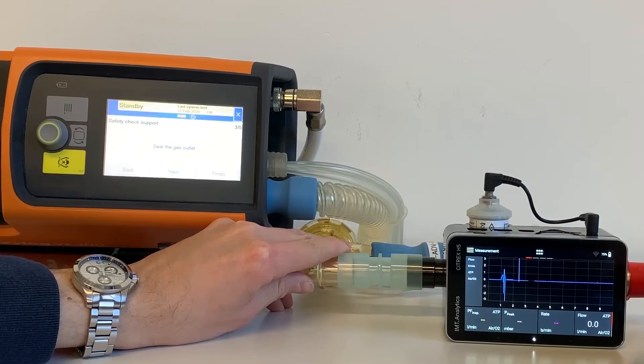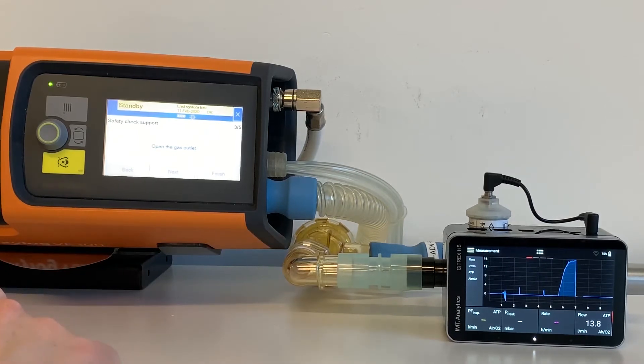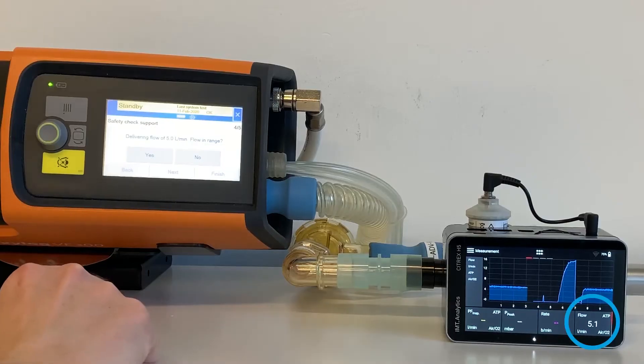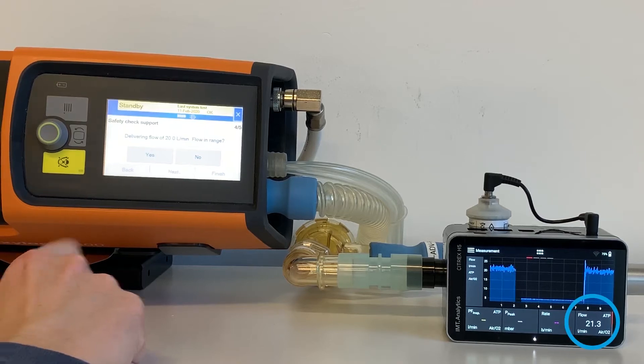Seal the gas outlet, then open the gas outlet. Check the delivering flow of 5.0 L per minute. Is the flow in range? Tap Yes. Check the delivering flow of 20.0 L per minute. Is the flow in range? Tap Yes.